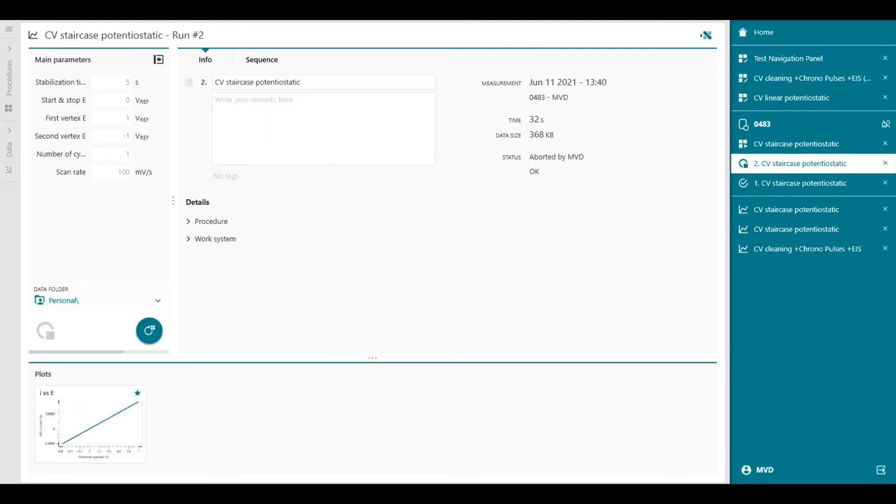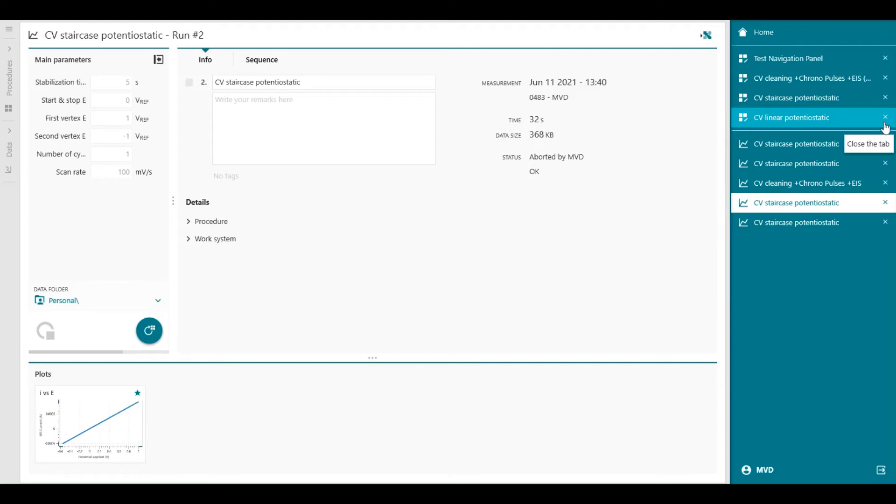Besides the name of the work system, there's also a button to release the work system. This button here. Release when you don't use the work system. A released work system can be claimed by another user in the network.